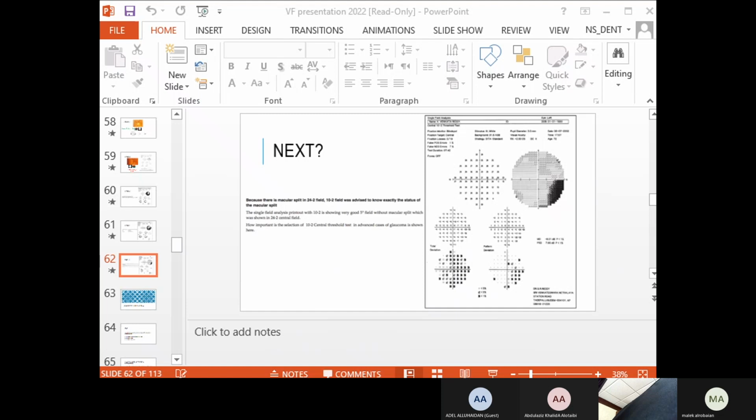What else? Can it be something else? The reliability is less than the first, so it might be a cause. Okay, let's say it's reliable. Anybody? Hamid? Yes, the duration is longer, but it's reliable. Would it be the refraction? Yes, this could be, maybe his refraction has changed.